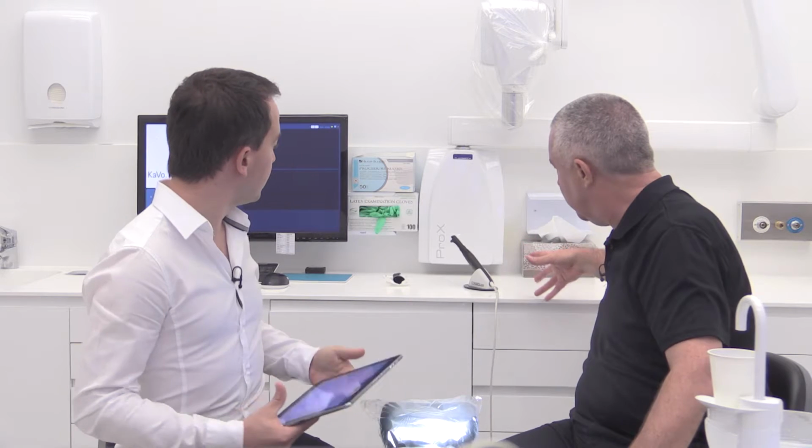So, as well as being a techno geek, you're also a well-renowned infection control guru. You've said that we don't need a barrier over the tip of the DIAGNOcam because that goes through the autoclave. That's right. How would you recommend sanitizing the rest of the handpiece? Okay, so the rest of the handpiece, when that slides off, which you've been holding in your gloved hand, wouldn't normally get saliva on it anyway, but it's been designed to be compatible with almost all the current surface products that are used for wiping down. So the impregnated wipes, those sort of things. It's got quite a nicely built surface that's quite impervious to those things, so you can wipe down the rest of it.